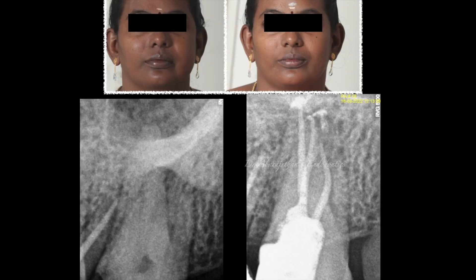Case number two is again a necrotic tooth with a periapical lesion — the patient reported with acute swelling. This is a left maxillary second molar, treated in the same manner with the four files. This was the second use of this particular set of rotary files, and you can see this tooth was a little more curved than the first — notice the nice curve in the disto-buccal canal.